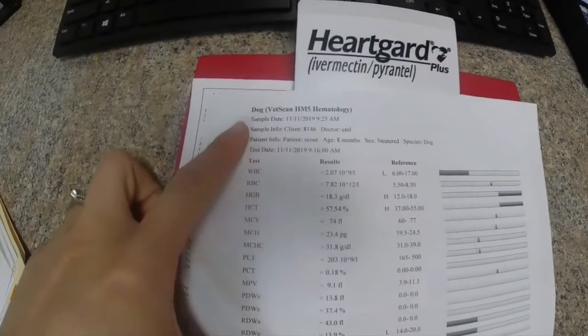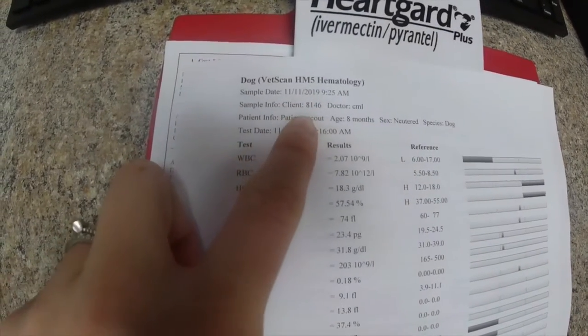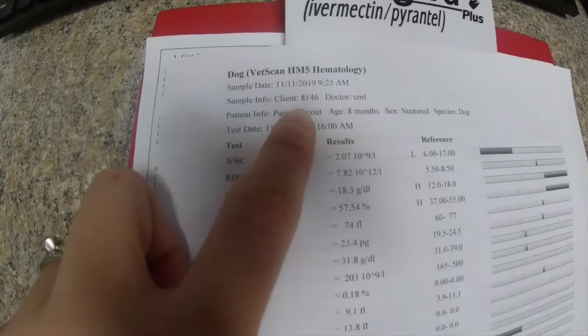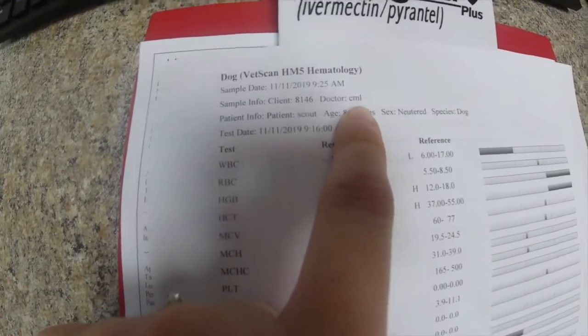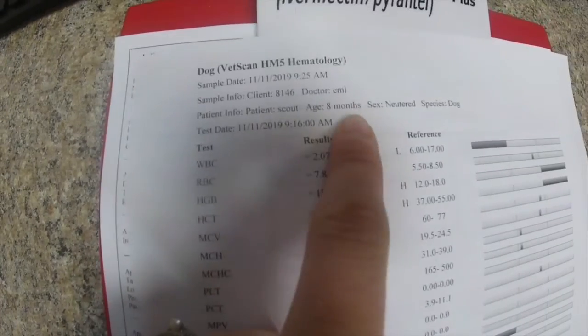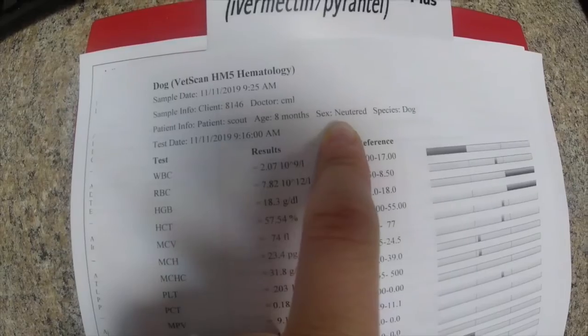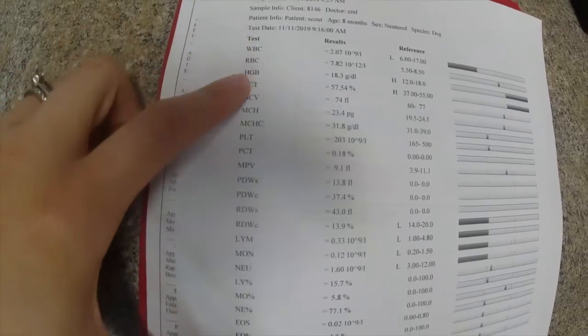This is a complete blood count. It has the day we drew the sample and the time, and the client's account number, the doctor, which is just Dr. Lindley's initials, the patient, the age, whether they are spayed, neutered, or just male or female in this species, and then the test date. So it has all of your white blood cells, your red blood cells, all the way down even to your platelets.